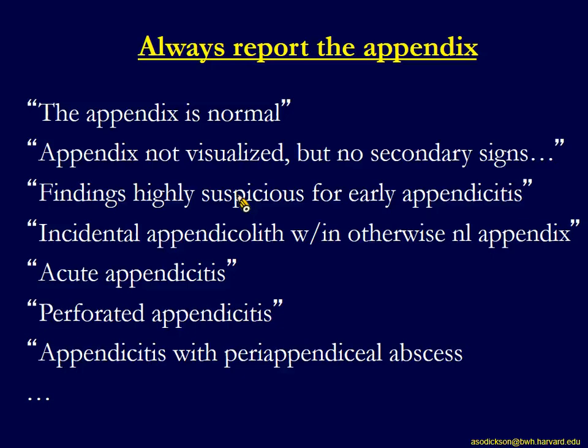Can I ask you one more question? Of course. Do you still believe that there is a diagnosis called early appendicitis? Do you still agree with the CT findings, or do you put this diagnosis because you know the onset of the symptoms or what? Because sometimes, like I asked you just now, the criteria for early appendicitis, subtle does not mean anything for us to train a resident.